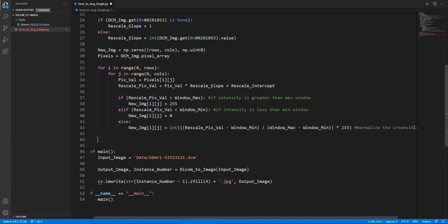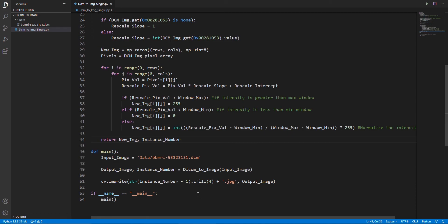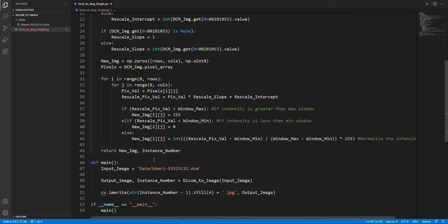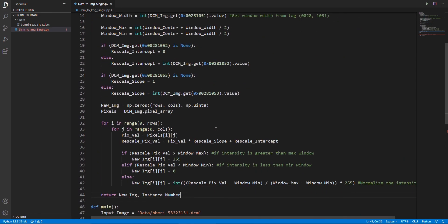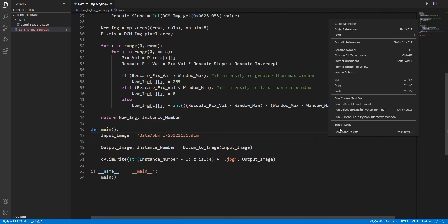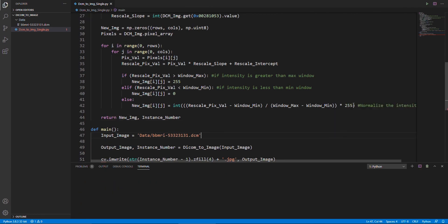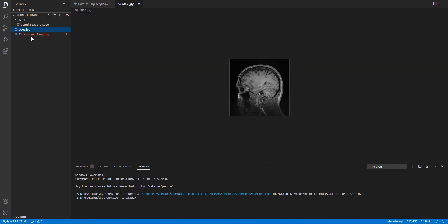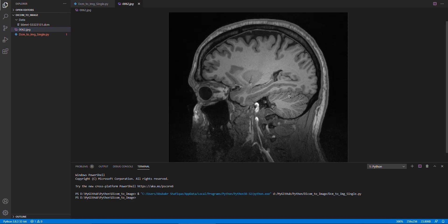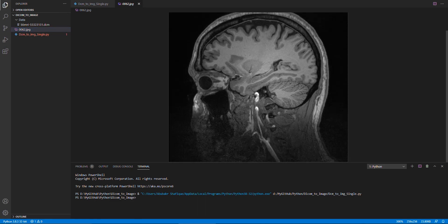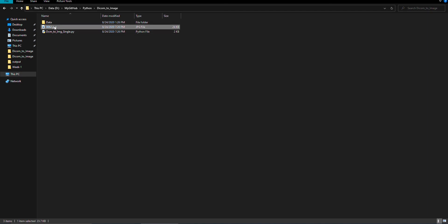Then we can return the final image and slice instance number to our main function. Now we can run our program to check the result. Here is our result, having good contrast levels, and it is very simple.